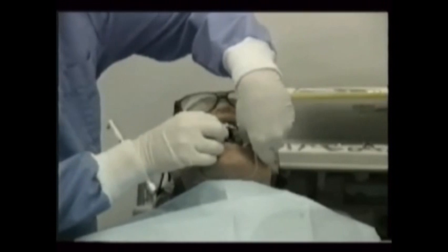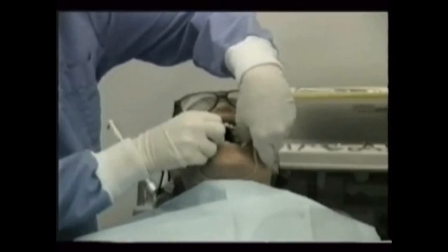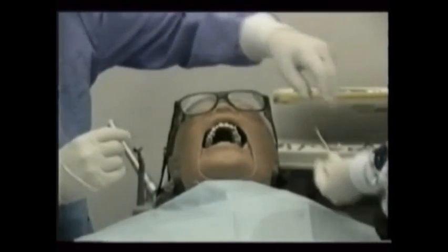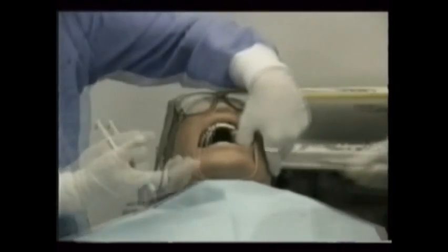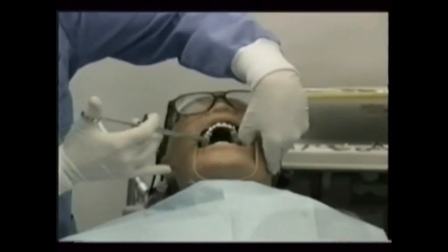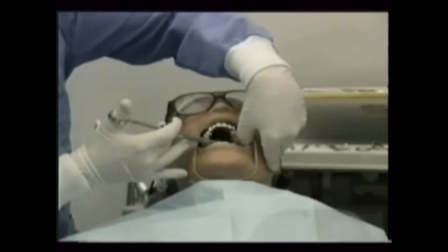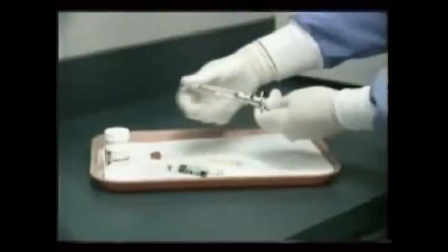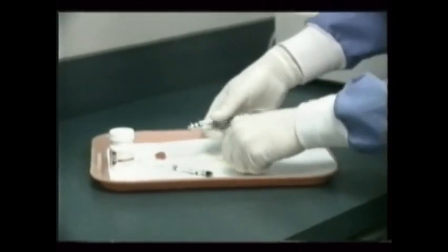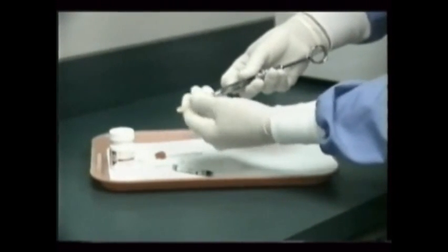Some oral surgery procedures can be provided using just a local anesthetic. Applying a topical anesthetic a few minutes before the injection helps increase a patient's confidence and also helps diminish fears. The proper anesthetic, usually one with a vasoconstrictor like epinephrine, plus the syringe and the needle preferred by the doctor must be available, but always kept from the patient's sight. Since profound numbness is desired, extra doses of the anesthetic may be administered over what might be used in more general dental procedures.